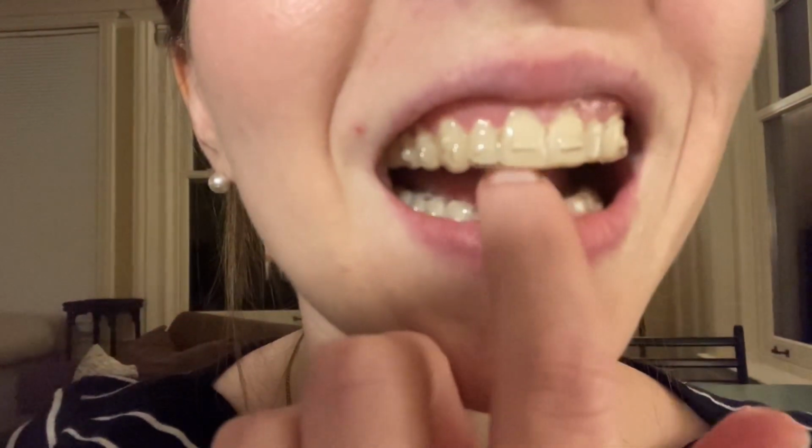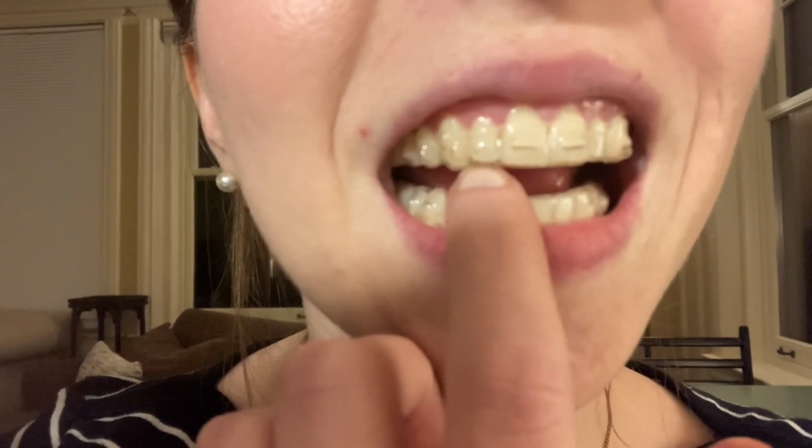And then the other thing is this tooth. Sorry if no one wants to be this close to my mouth, but here we are. So you can see this tooth just didn't track quite right for my whole treatment. You'll see that the tray is further down than the tooth itself. So the tooth is still a little bit too high up and it's a little bit too far forward. Right there. So I want to fix that.